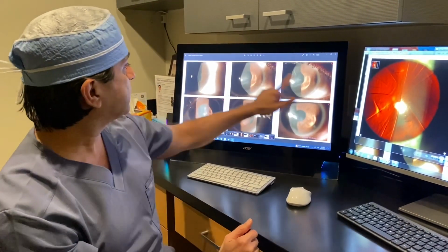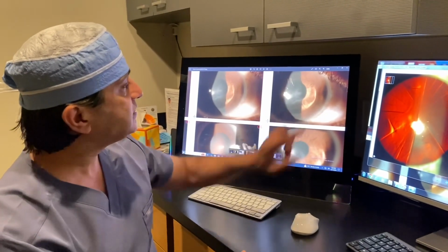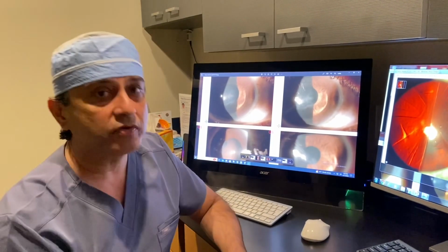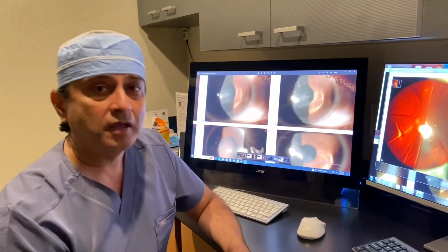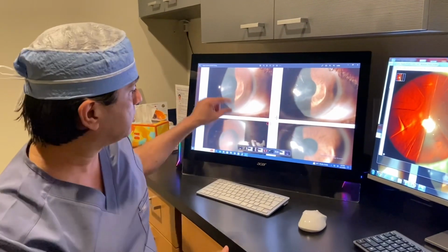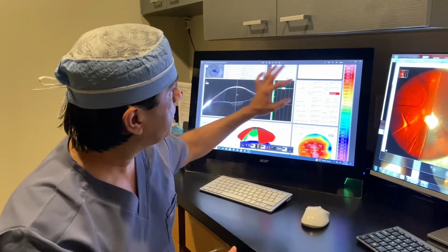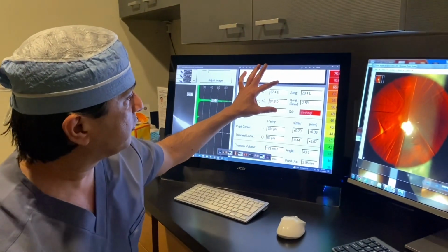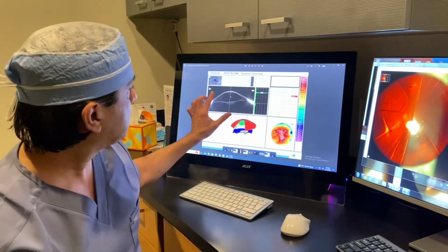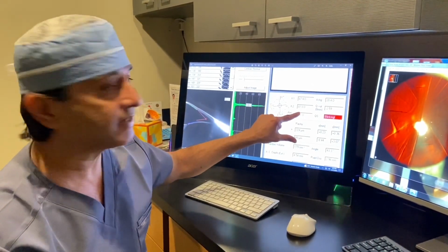Right? Here's a patient with extreme keratoconus corneal scars. You can see here. She has 90 diopters of keratometry, 90. Cornea is less than 200 micron, central scarring, and over 20 diopters of irregular astigmatism. I'll show you this patient's topography. In fact, here this is 20.4 diopters irregular astigmatism, if you can see here. Right? Cornea thinness 80 microns, you can see here. Complete scarring, extreme keratoconus. You can see keratometry is 87.8.